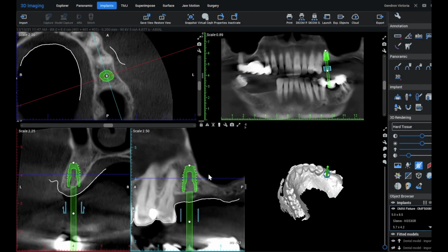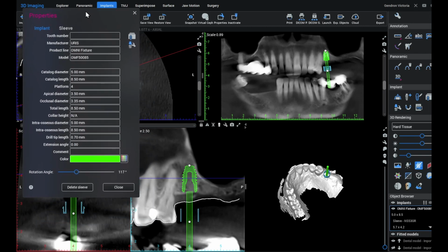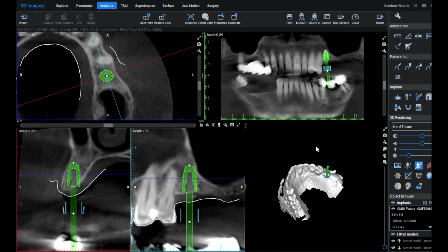Okay, let's look at another example in detail. So this is a maxillary case. Again, it's probably not necessary to use this method. It just so happens that these are the implants that I was planning today, so I'll use these as examples. But you want to plan your implant using just your normal implant planning workflow.